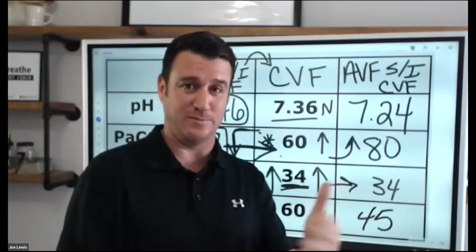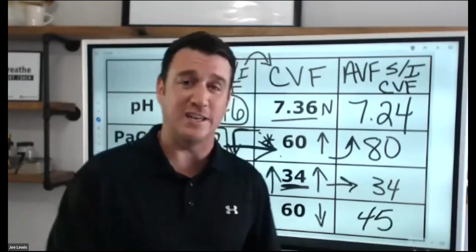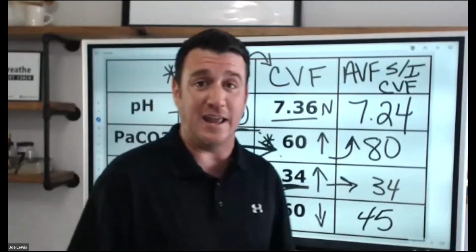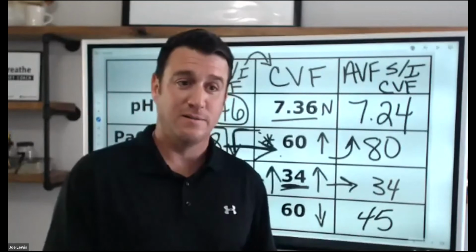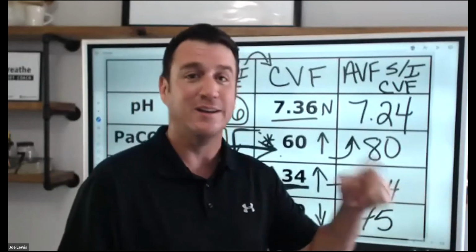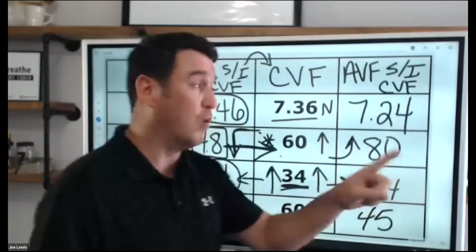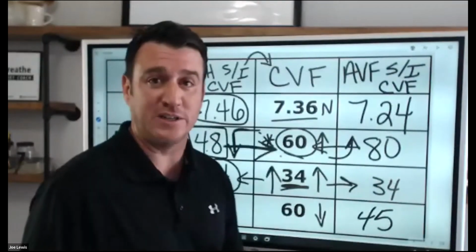How many times, respiratory therapists, raise your hands, put it in the chat, something. How many times have you seen a COPDer come in with a CO2 of 80 and 8 hours later, we got a CO2 of 40? Yeah, right? We said, well, we've got to normalize CO2. We got to get 35 to 45. No, we don't. We have to get back to what? Their normal. How do I know what their normal is, Joe?